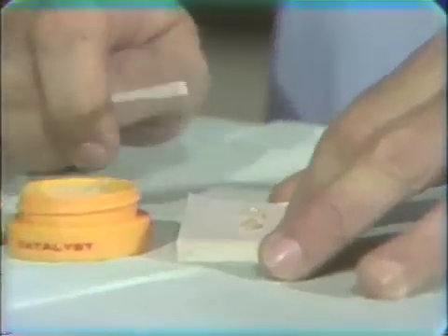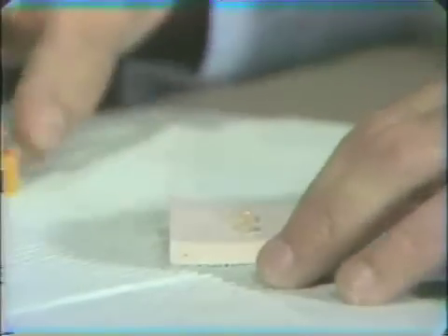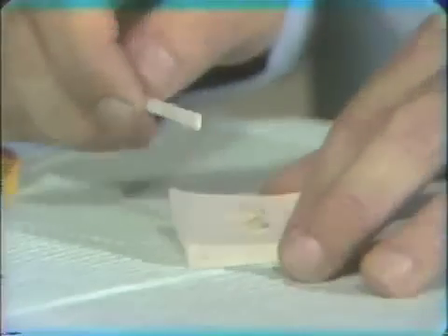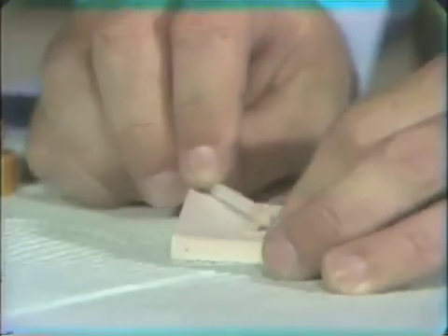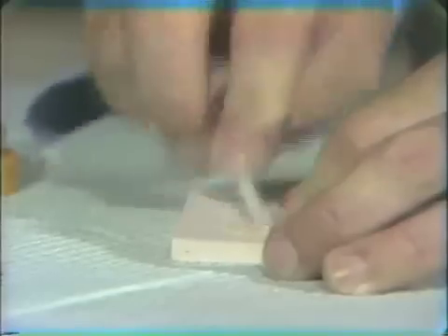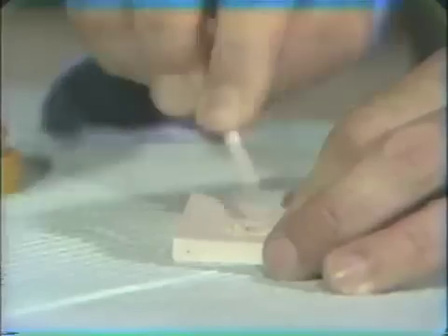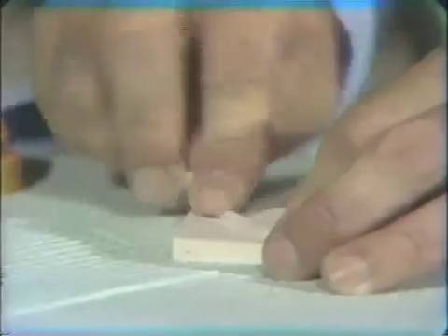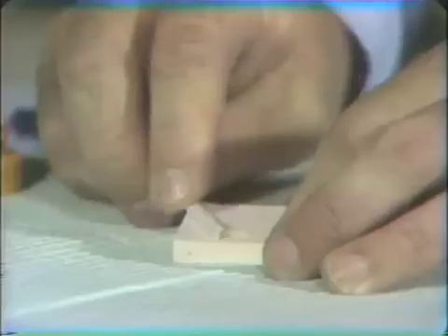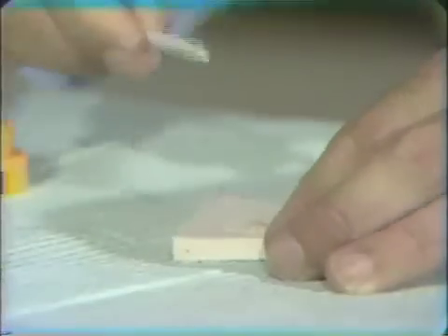Now, the ladies in the dispensing clinic will take care of this for you, and they will dispense it on a pad such as this for you. Now we are ready to mix. It's a matter of just putting the two of them together for 20 seconds, mixing, patting, keeping it in a small area because you have a small amount. It will become one color. They are very close to begin with, so you have to watch this, and it is best to time it.